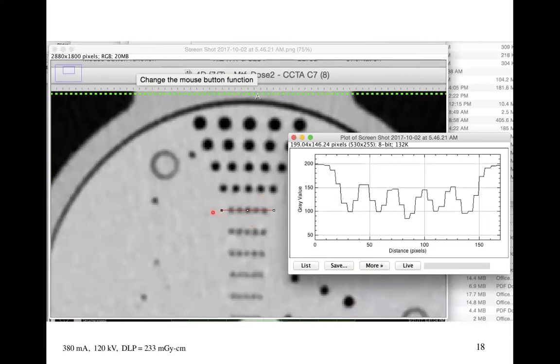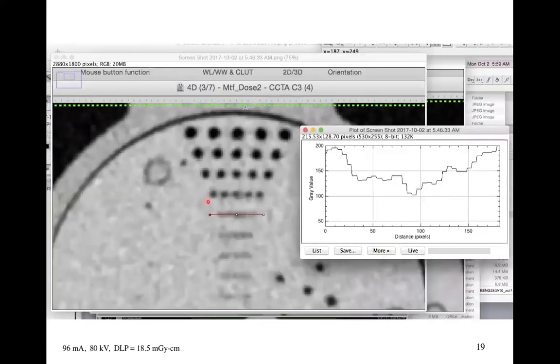So we can plot what this looks like. Here we have the contrast, right? So this is a modulation transfer function again, where we get the amount of modulation on the signal for this spatial frequency or separation of the dots. And we look at it after we've had to do averaging to keep this noise value reasonable. We can see we pretty well lose all the detail in that feature. We still have this feature, but that feature has been sacrificed.